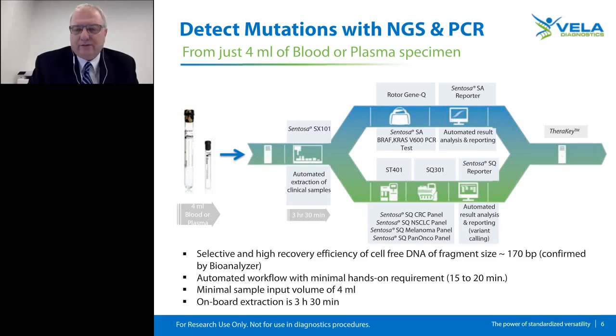Just as Gerd had mentioned in the prior presentation, both systems have automated reporting associated with them, and we also have the capability for the oncology assays to utilize a new tool for providing enhanced data analysis through a software called TheraKey, which is being offered through Vela Genomics as a service, okay, globally.